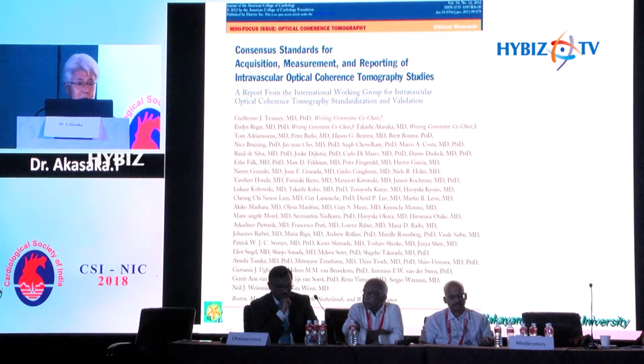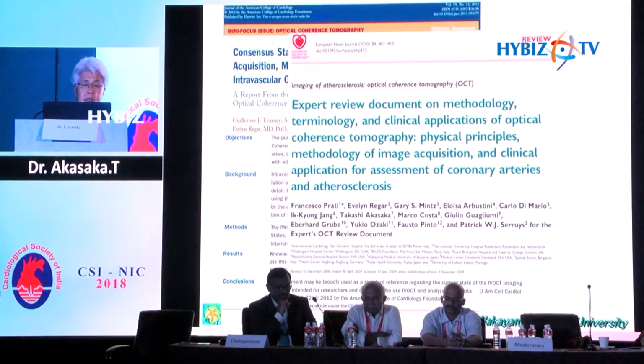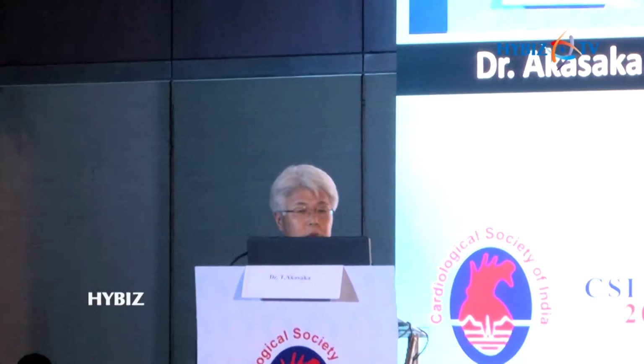So based on these data, there are lots of consensus documents to recommend OCT in clinical practice, and this is an expert review, and also this is an expert review. And this is one of the data showing the OCT superiority compared with angio-guided PCI. If you use an OCT, death rate, cardiac death, and also myocardial infarction are significantly smaller than with angio guidance. It is a retrospective single-center study.